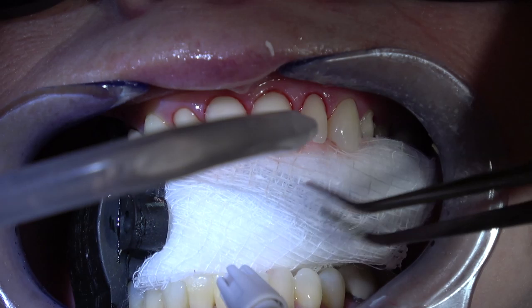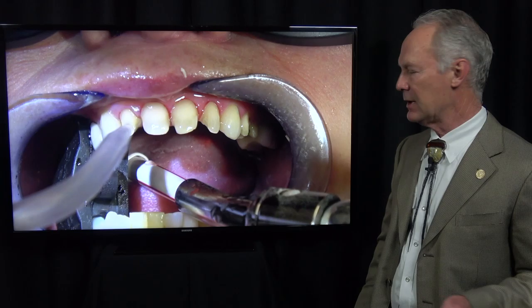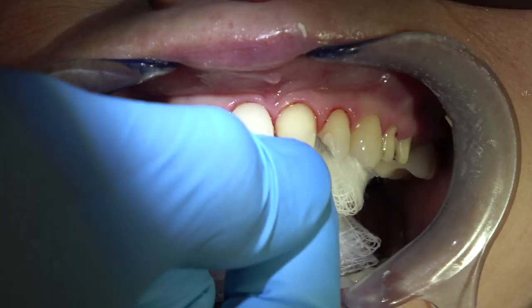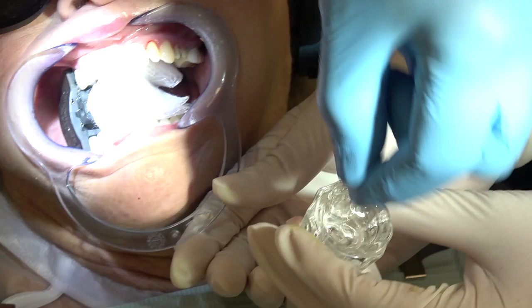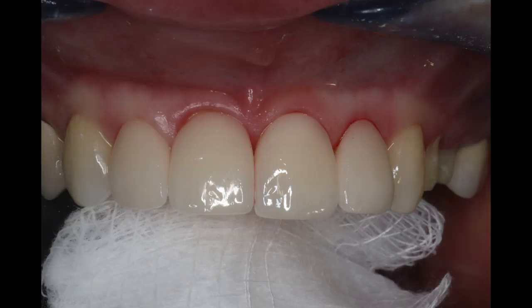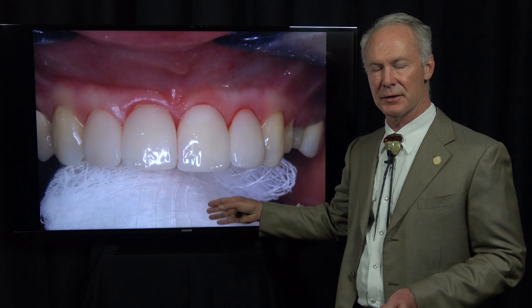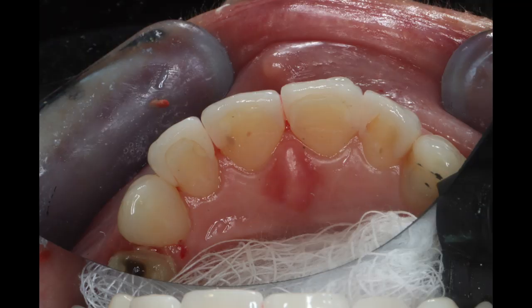And this is ice cold water. This is not warm water. This is ice cold water. And it, again, helps with hemostasis. Trying the veneers on. There should not be any interproximal adjustment because you've used a stone model to perfect the interproximal contacts. If you try to create ideal interproximal contacts on a die model, they're not going to be ideal. You've got to use a stone model.